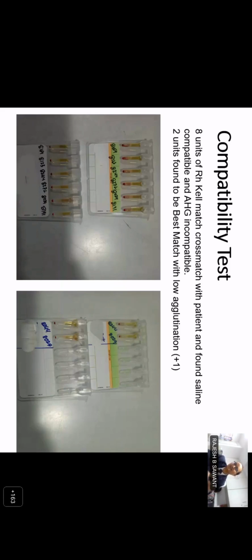Only a 30% chance that any non-RH antibody may be underlying those autoantibodies, and that can still cause hemolytic transfusion reactions. Okay, so this is the titer cross match with the 2 units that I showed you. You can see over here, in the subsequent dilutions, after the 1 in 4 dilution, a clear-cut compatible result, isn't it? This is the unit number. So these units are found to be compatible at a titer cross match of 1 in 8.